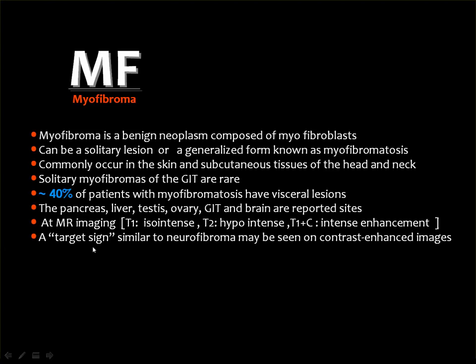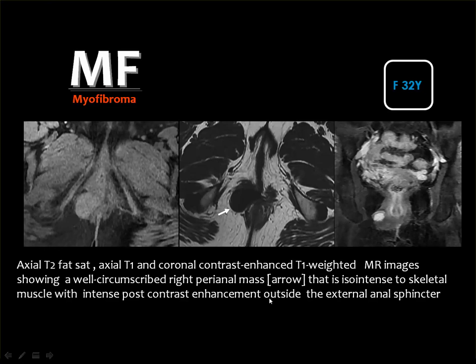And sometimes, because of its similarity to the neurofibroma, it may show the characteristic target sign, which is one of the diagnostic criteria of the neurogenic tumors.